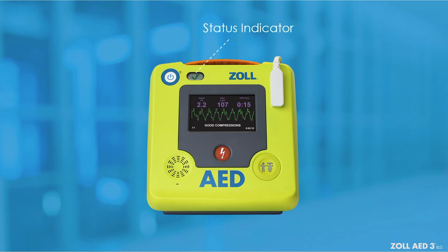The status indicator provides a green check, helping to visually indicate that the Zoll AED-3BLS passed its last self-test and is ready for use. No green check indicates that the AED has not passed its last self-test or a battery has not been installed.